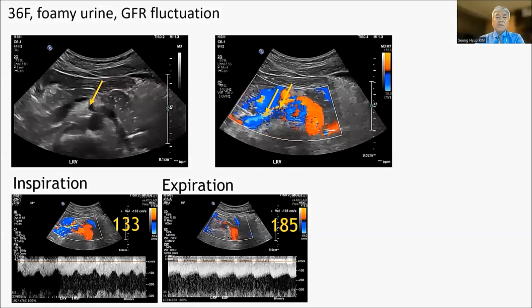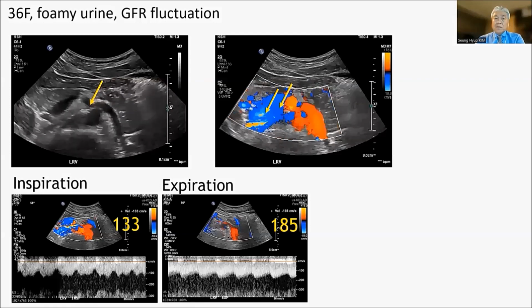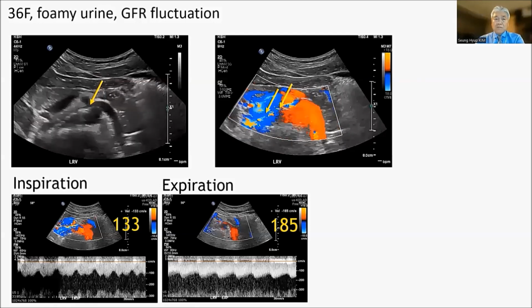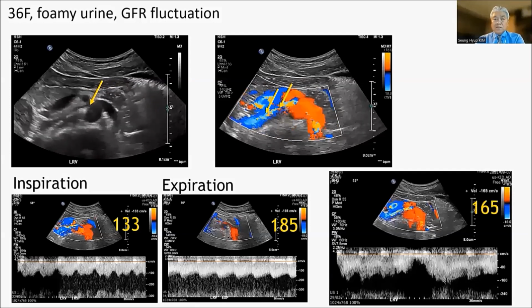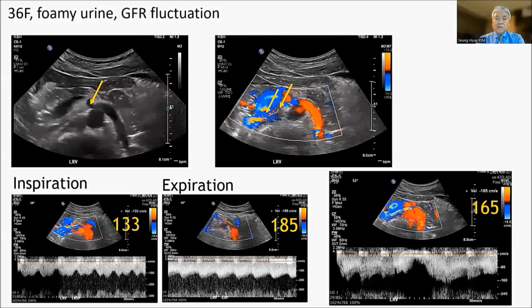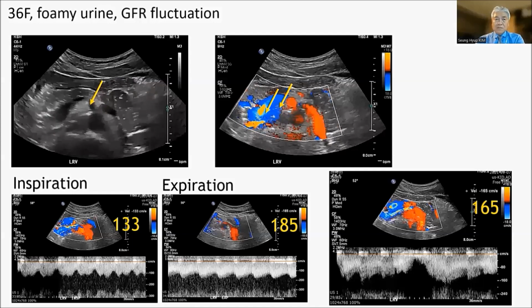The best way to make the patient comfortable and to get nice spectra is to obtain Doppler spectra with the patient keeping shallow, comfortable breathing like this. And we see the respiratory variation, but we can measure peak flow velocity easily, which was 165 centimeters per second.